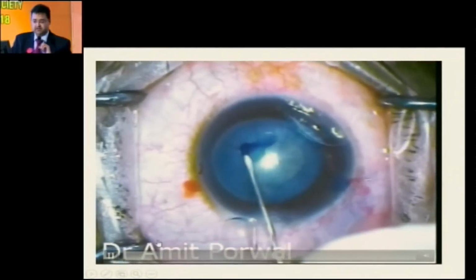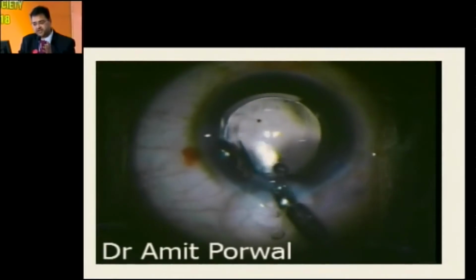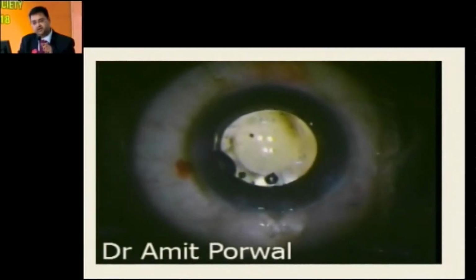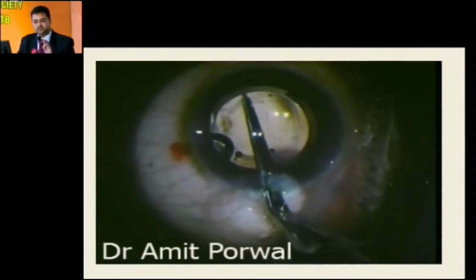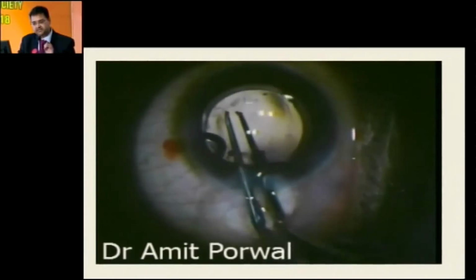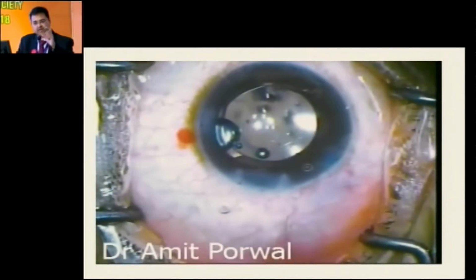3.5 millimeter, and then most of the time, as I told you, the cataract is usually soft, so you perform the phacoemulsification, inject the IOL, and then you can extend the rhexis by giving a small tangential nick, as was told earlier, and with the help of a high density viscoelastic substance, you can now enlarge the rhexis. So basically, the smaller the rhexis, the chances of giving way are very less, and by using this maneuver, this is one of the other options available. So you can nicely trim the rhexis and have a good overlap of the anterior capsule over the optic.